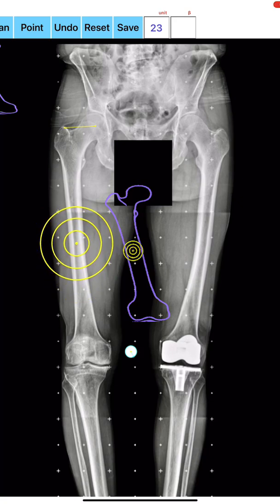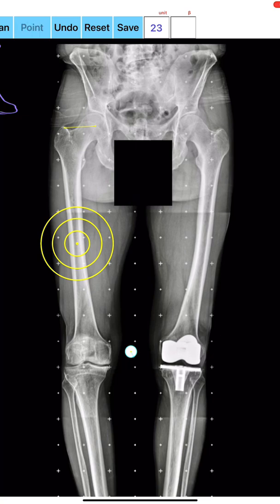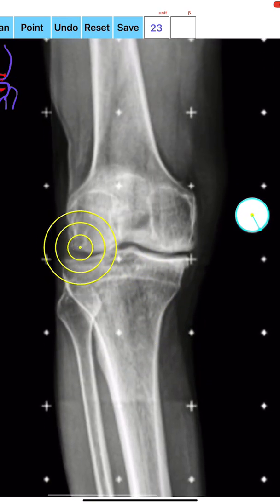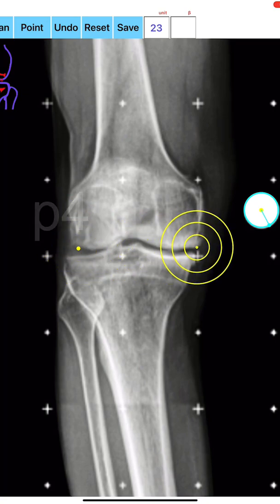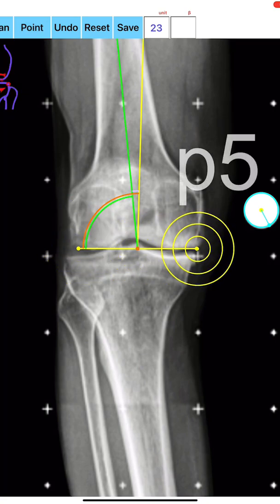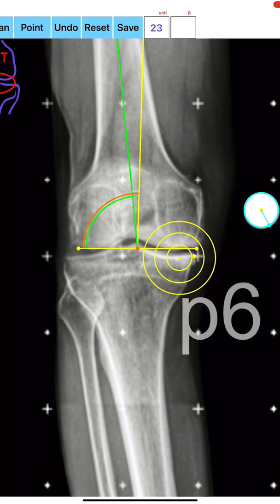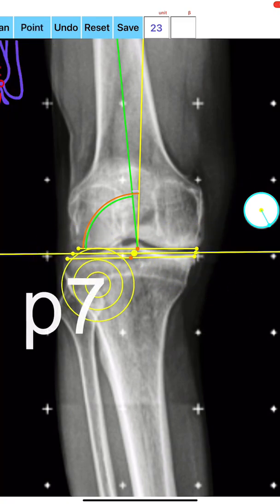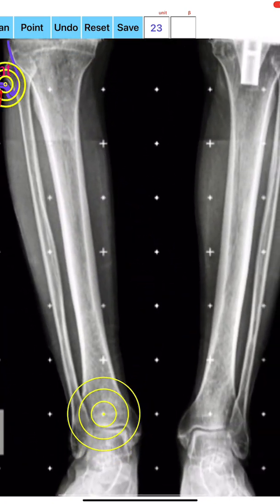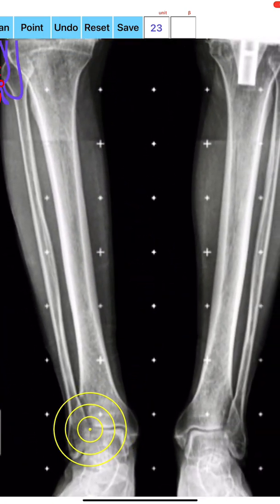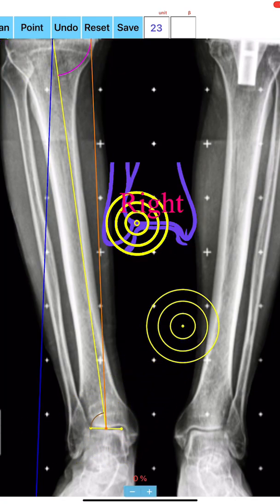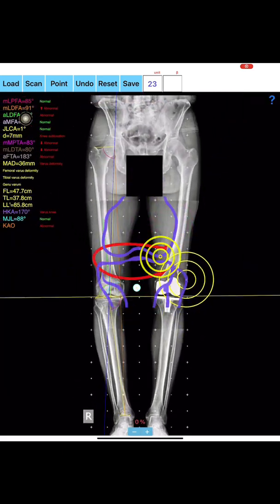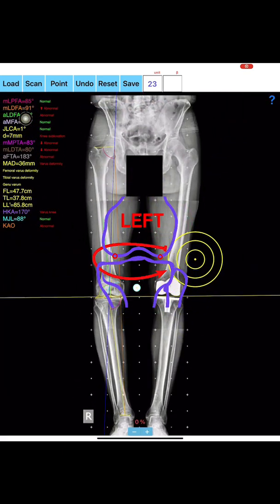In case the right limb is measured, the user should select the following anatomical points sequentially in a clockwise fashion: starting from the most distal and lateral point of the lateral femoral condyle P4, to the most medial and proximal tibia point P6, to the most lateral and proximal tibia point P7. For the distal right tibia: the most lateral distal point of the tibia at the ankle joint P8, to the most medial distal point P9. For the left limb, the same pattern is followed but points are selected in counterclockwise fashion.